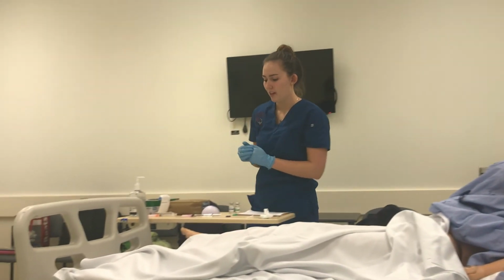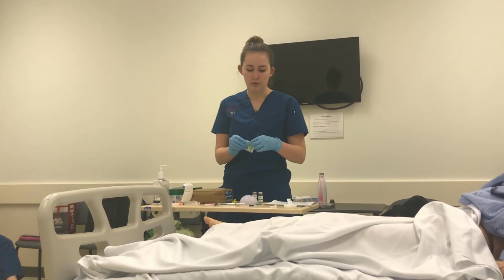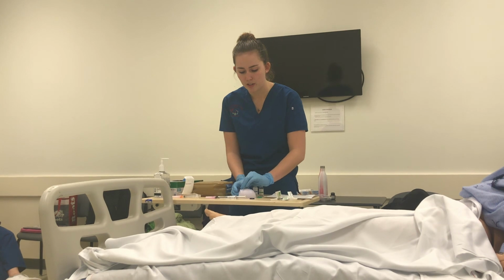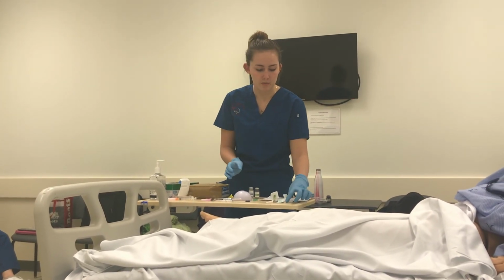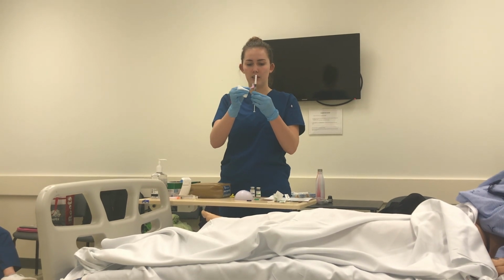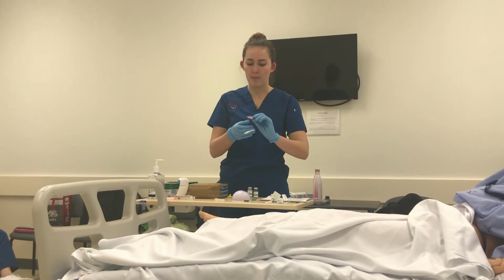administer the medication. So moving on to our injectable pad, I'm going to make sure to clean the area using an alcohol swab, again using the same technique as the subcutaneous, starting from the middle, circling in an outward motion 5 centimeters. Making sure to prepare gauze in the non-dominant hand, uncap the safety needle, like so. And we're not going to pinch for an IM injection.